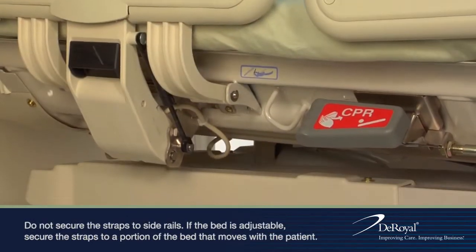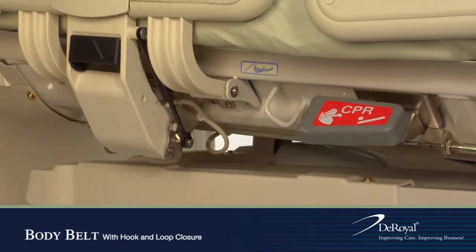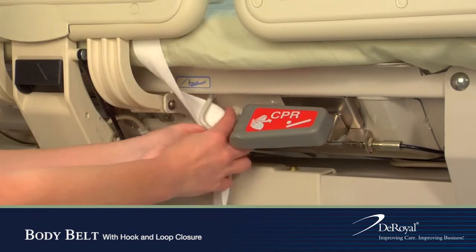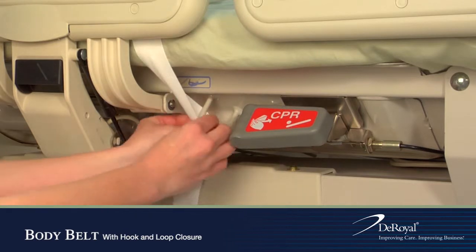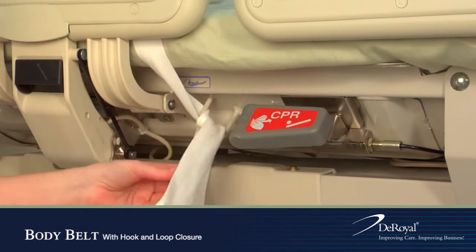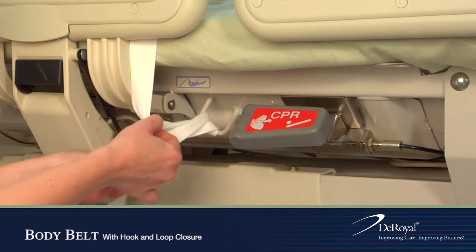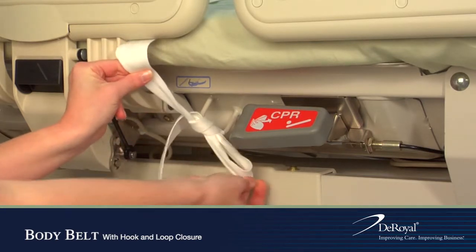To secure the straps, find a place underneath the bed that moves with the patient. Wrap the strap around the anchor two times. Then pull the strap through by forming a single loop to create a quick release tie. Secure excess strap out of the patient's reach.